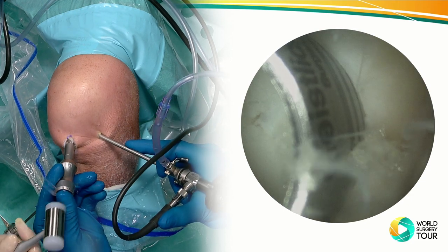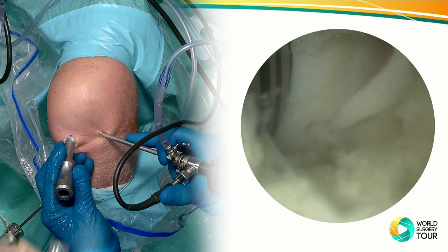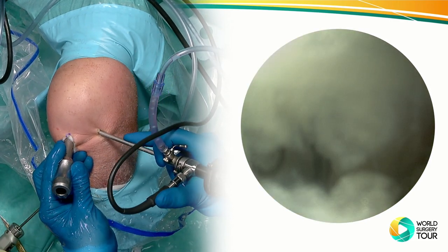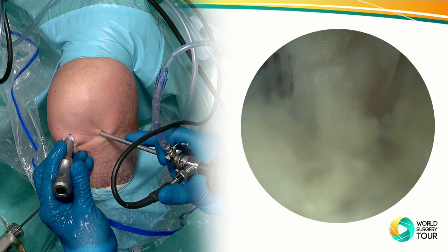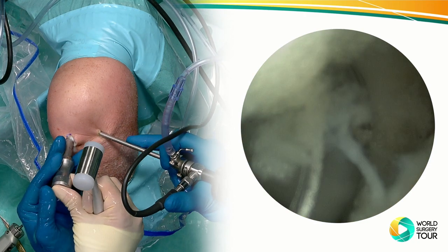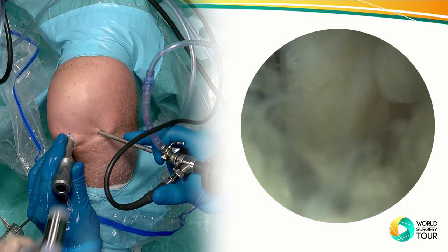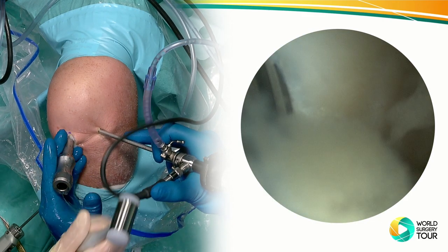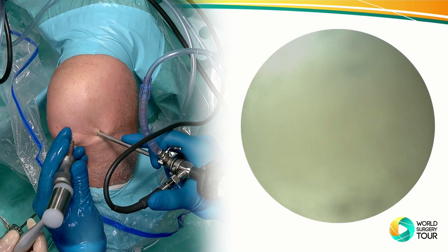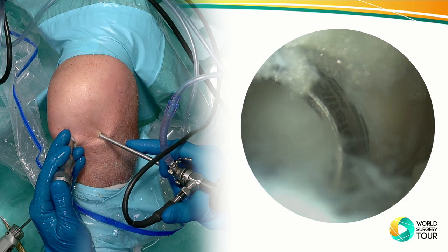Too bad. Okay, careful. Here we go. Yeah, right. Go a little more. Okay, finger on, check it again. A little more we can give it. Okay, check again. A little more, slight touch. Good. Okay, he's flush.